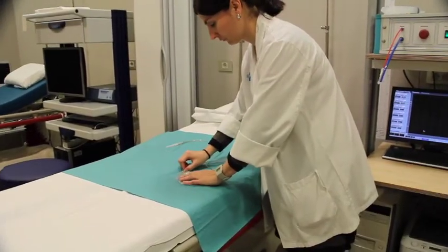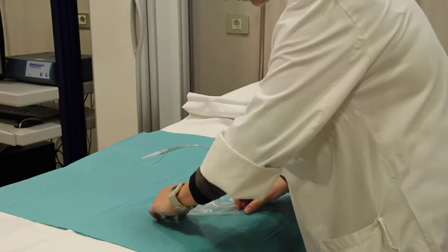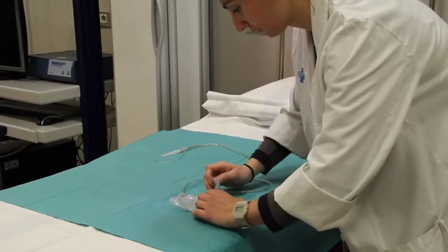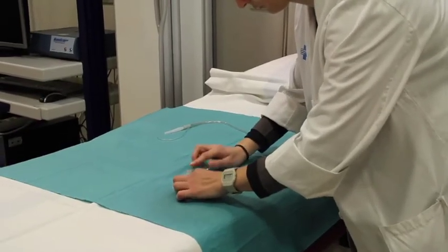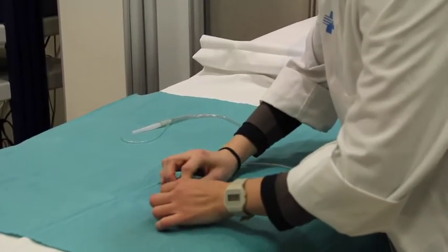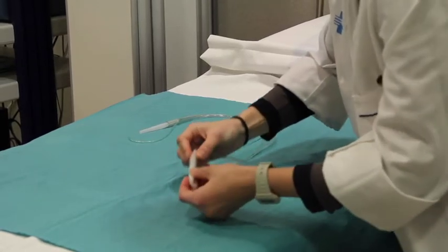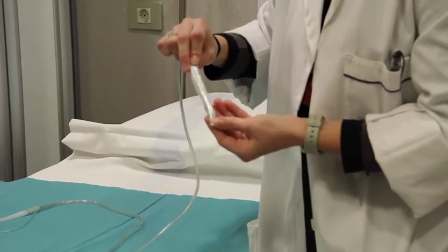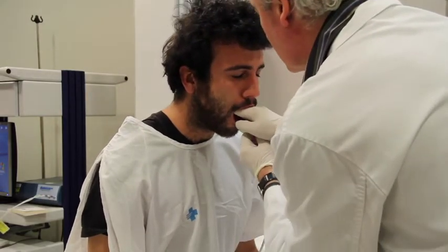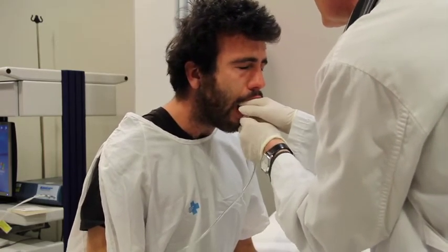I will demonstrate the preparation of the barostat bag for intubation. We need to fold the bag accurately to facilitate intubation. We introduce the bag through the mouth and protect against the vomiting reflex by leading the tube to the lateral side of the throat using our fingers.